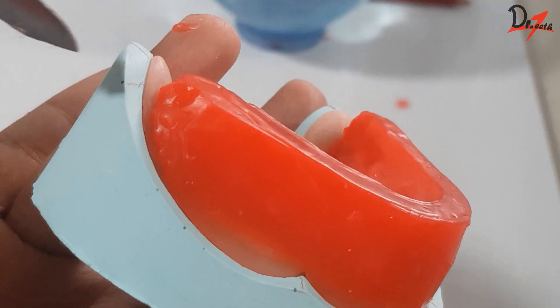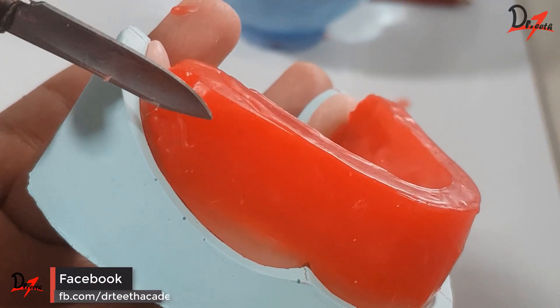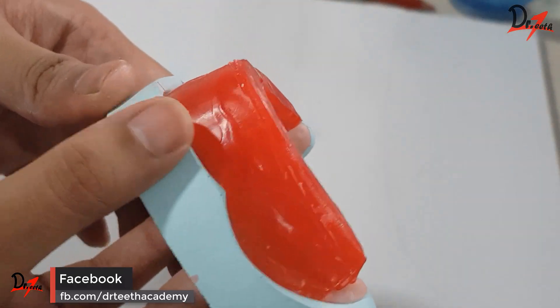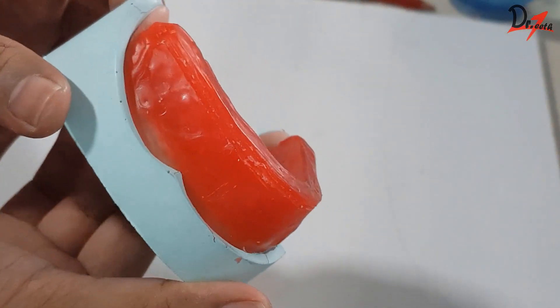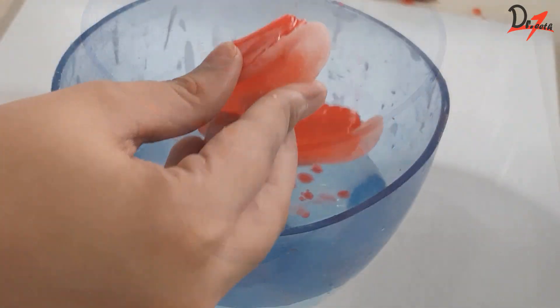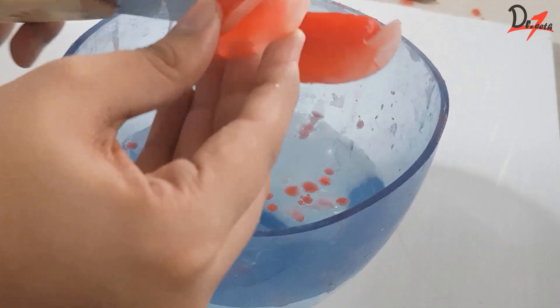Posteriorly, the height should be at the junction of the anterior two-third and posterior one-third of the retromolar pad. We will mark the height throughout, then take the hot plate, heat it, and reduce the height accordingly.